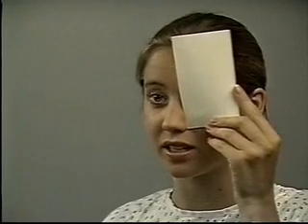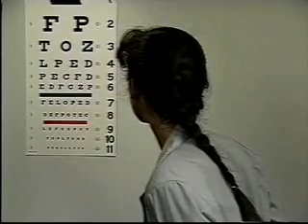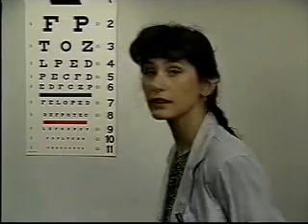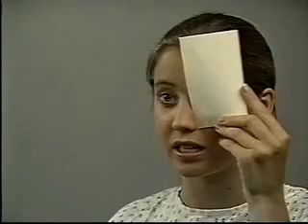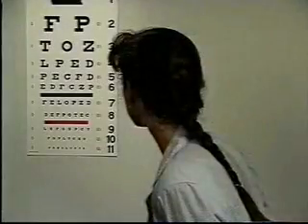Note the visual acuity printed at the side of the line of the eye chart. Ask the patient to try to read the next line down, then repeat the test on the other eye. Remember to record visual acuity using two numbers, such as 20-20, which is normal.